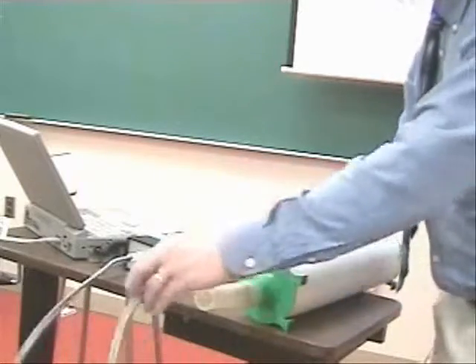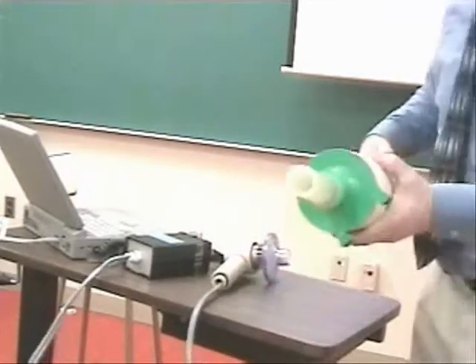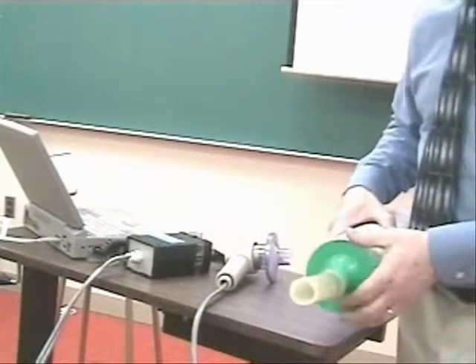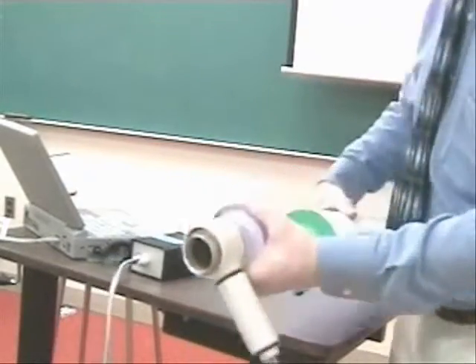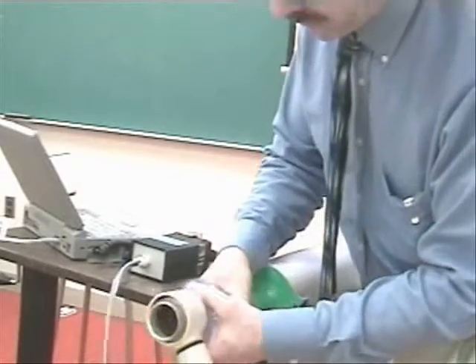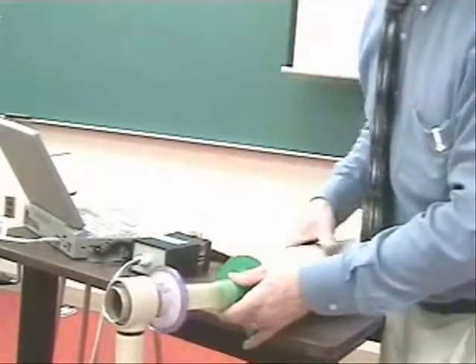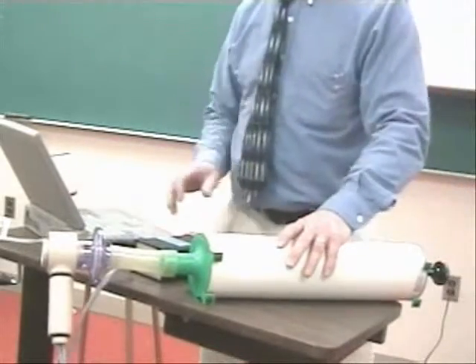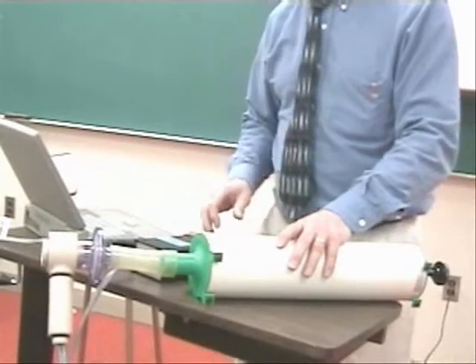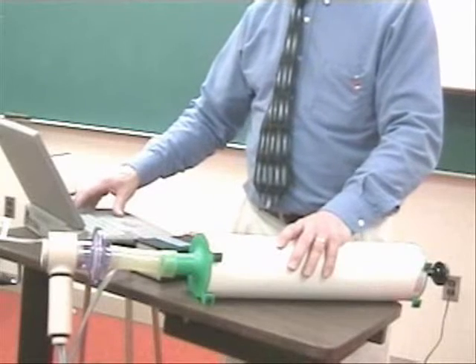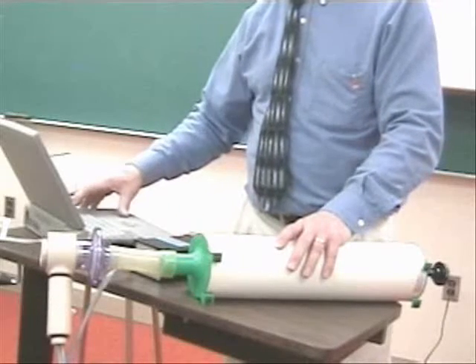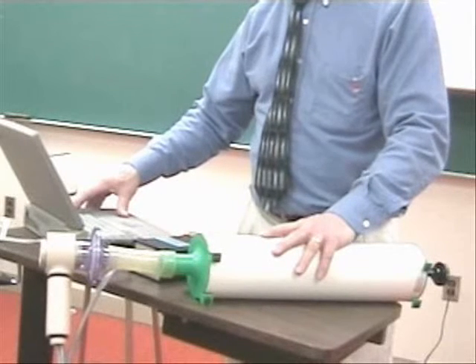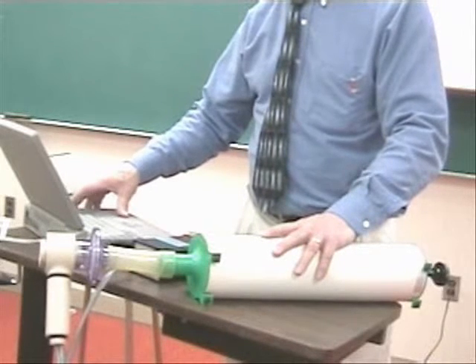This large device next to it is a calibration syringe, which we're going to first use to calibrate the spirometer. We'll attach the pneumotach to the calibration syringe, and then go into the calibration mode, set it to deliver a 3 liter volume. That's the size of this syringe. Room temperature will go with 24.